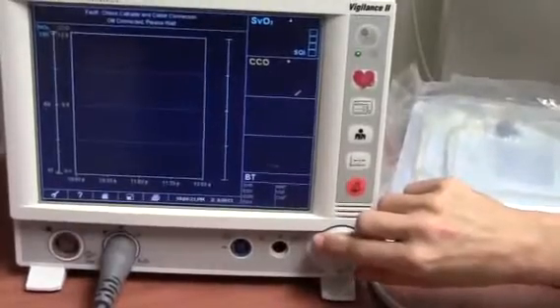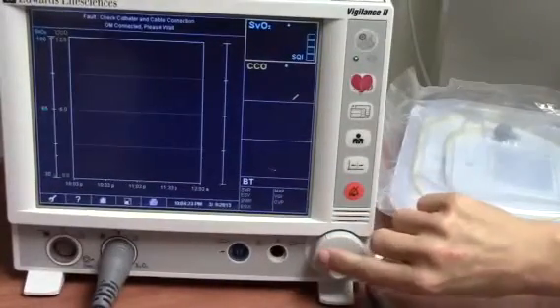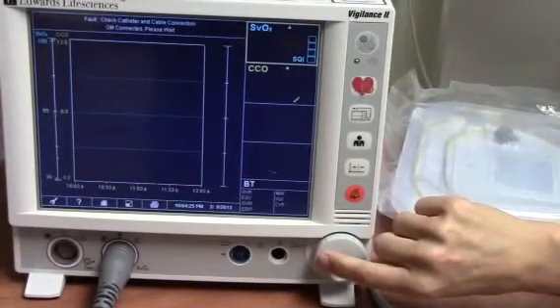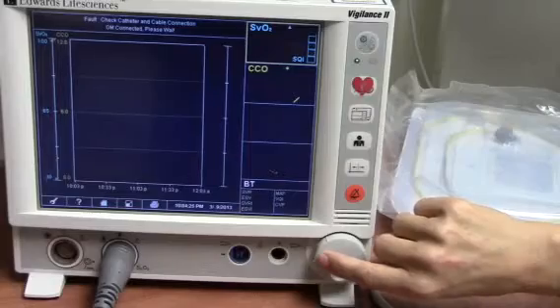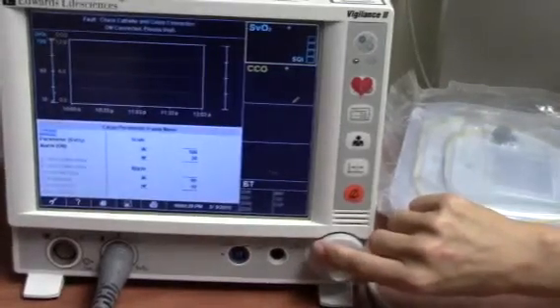Navigate the knob to highlight the SVO2 large parameter frame and push to display the menu.